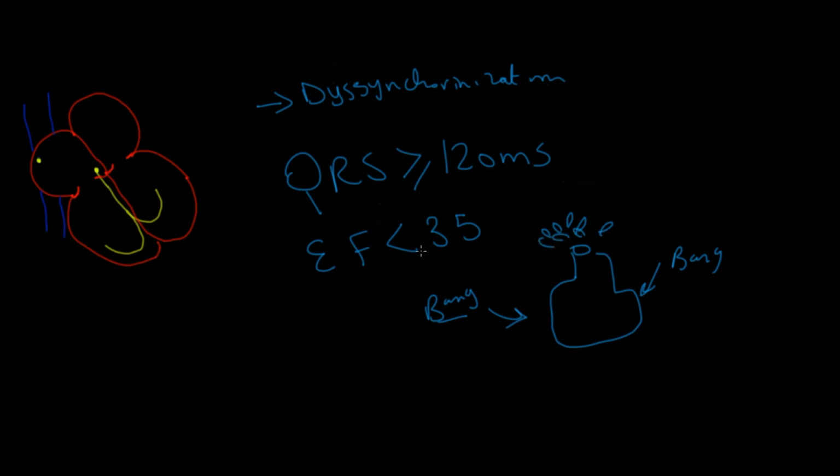So it's exactly the same principle that happens with the heart. If you give it stimulus from both sides, both beating in a synchronized beat at the same time, more cardiac output and much more improvement of the heart failure symptoms. You have to remember that biventricular pacing needs to be as close as 100% pacing most of the time.